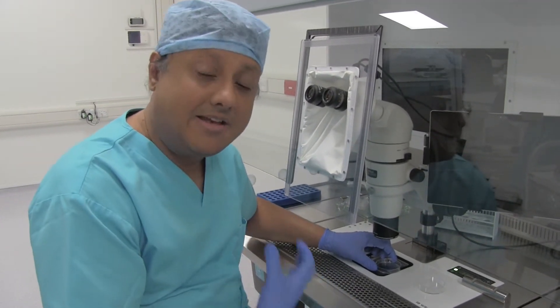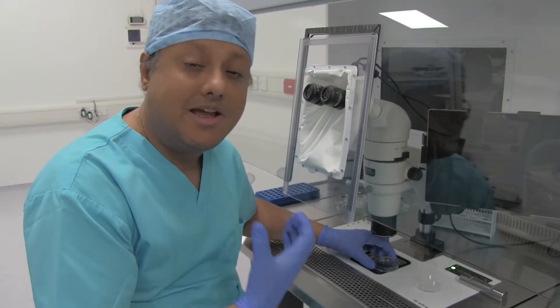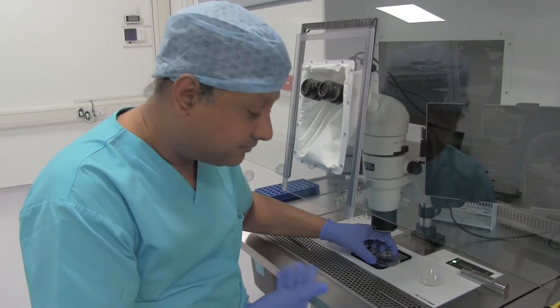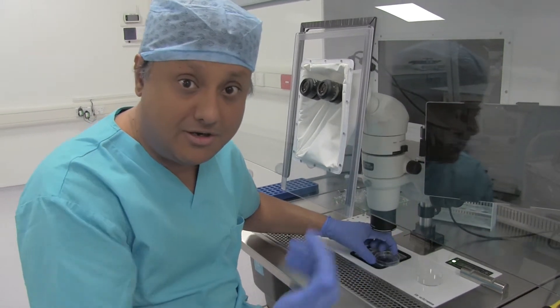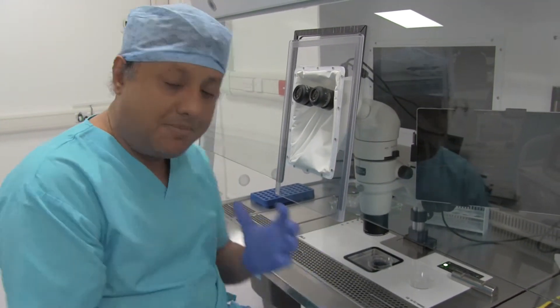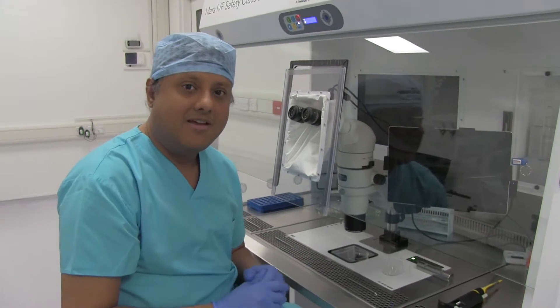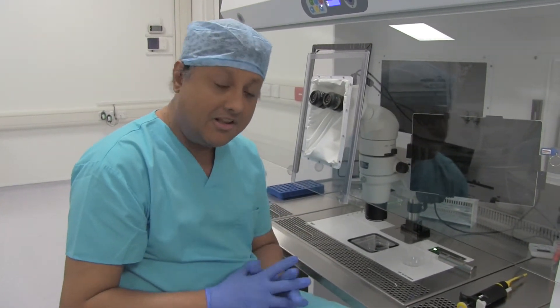But if you do not find the egg, it is quite important that the embryologist grades the health of the granulosa cells that are coming out. Because a lot of the time if the egg is not there, you need to be communicating that information with your clinician who is literally just over the door. Typically on the day of egg collection, the embryologist would communicate by telling them 'found the egg' so that the clinician can move to the next follicle.